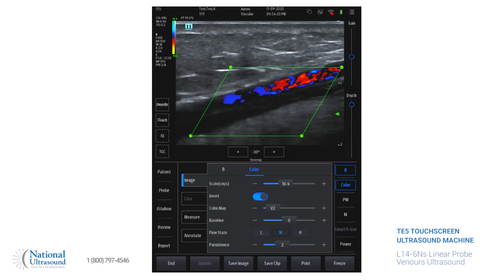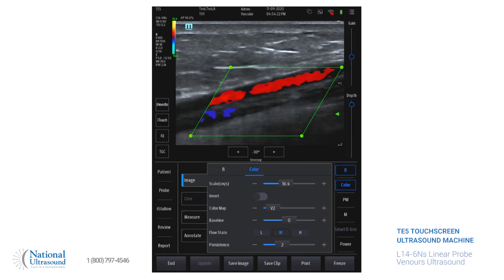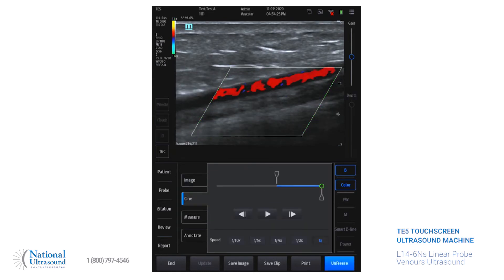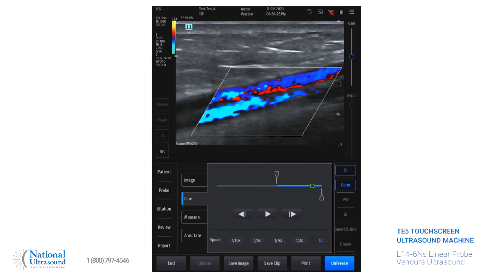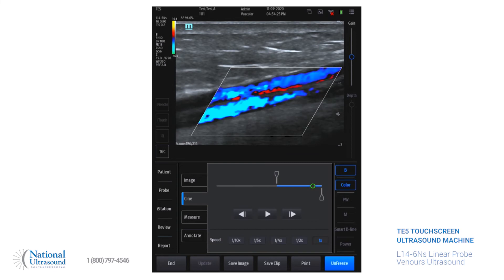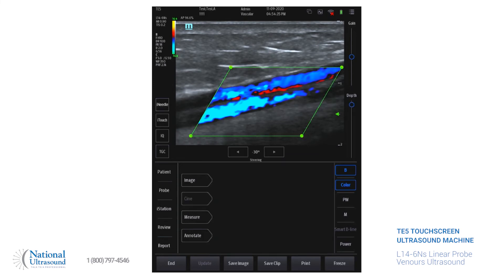We're going to go ahead and change the invert and take it off. So we're going to take a color picture. With the freeze, you can move it wherever you want to for maximum filling in as a color in the lumen. Then we'll do pulse wave.